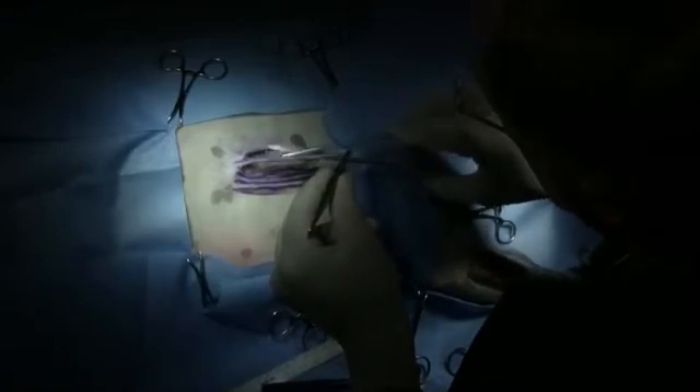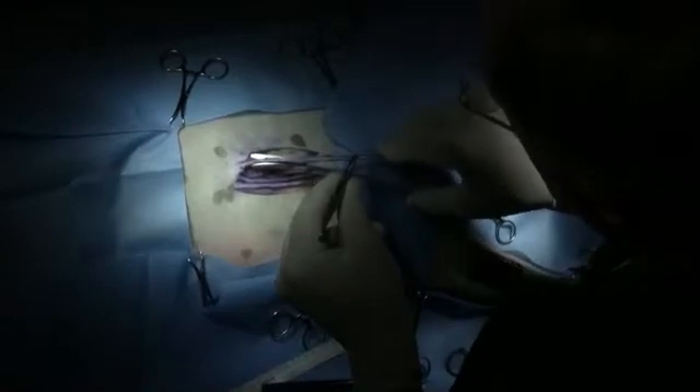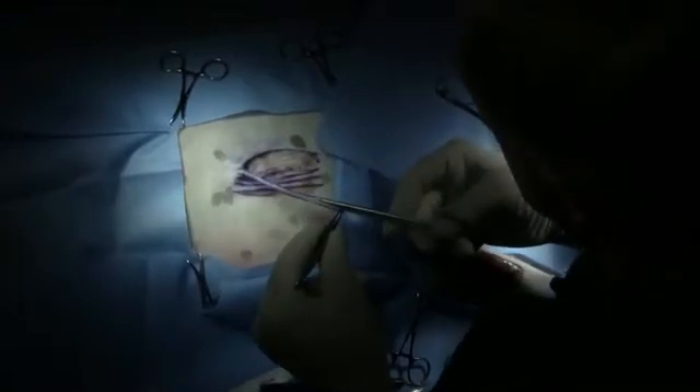It's much easier to do it this way — to cut that subcutaneous tissue off of that graft doing it this way — than to cut that thing loose and lay it out on your surgery table and chase it around like you were trying to spay an earthworm to get the fat off the back of that graft. We now have the subcutaneous tissue removed from this graft, so we're ready to harvest it and place it into one of the grooves that we've made.